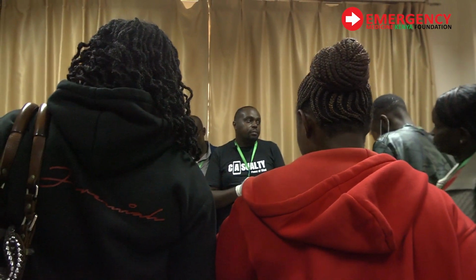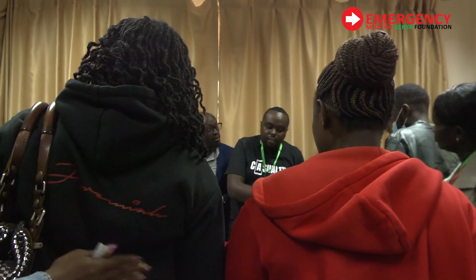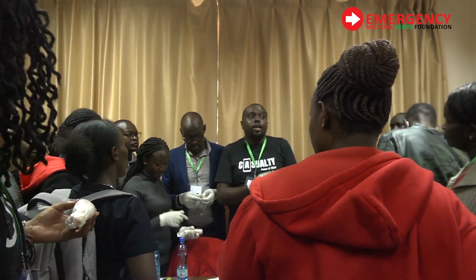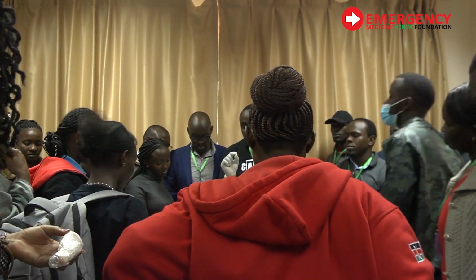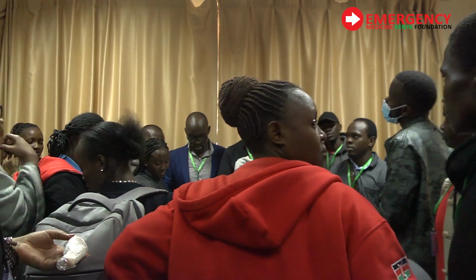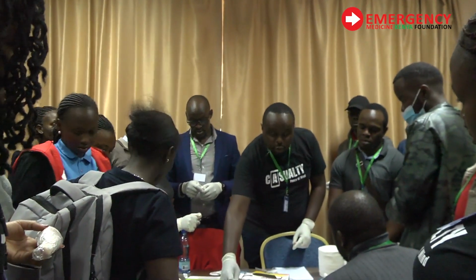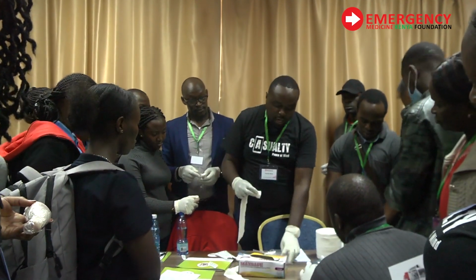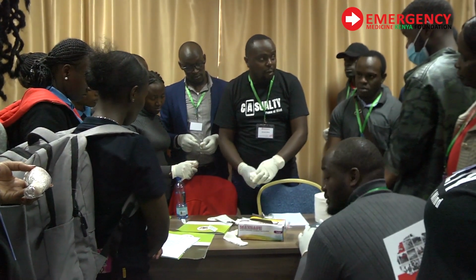8 hours. What is the answer? Till you get an IV access. So that prompts me to explain the next thing. Once you have your IO access, you need to secure it, otherwise it will fall off. The easiest way to secure it is, once you are sure you are in, you take a piece of gauze and wrap it around the needle firmly.